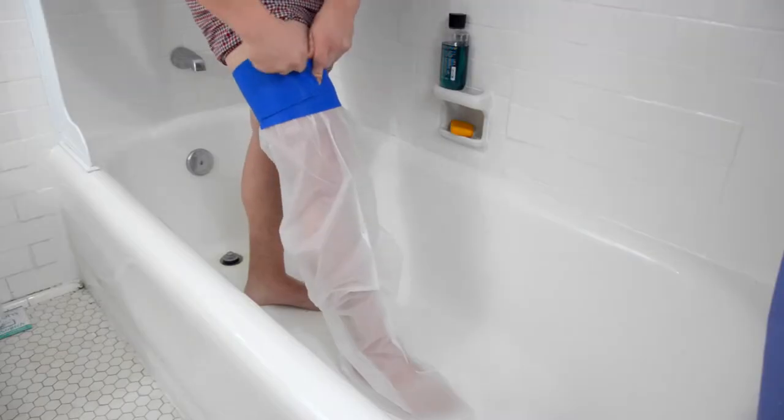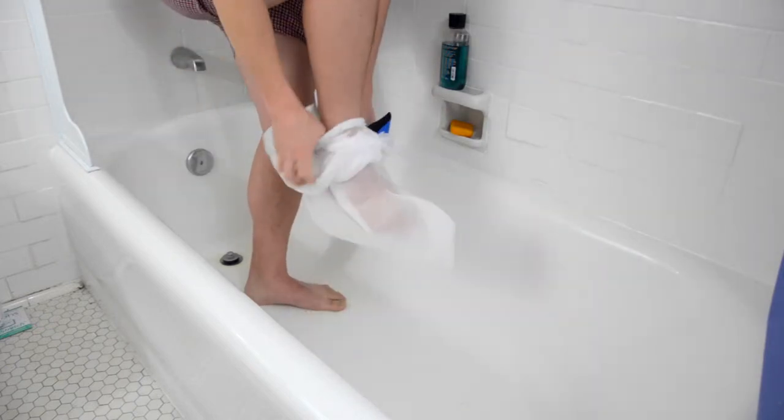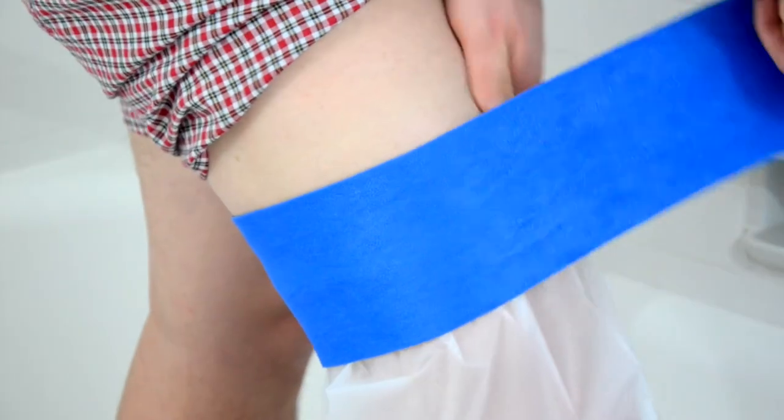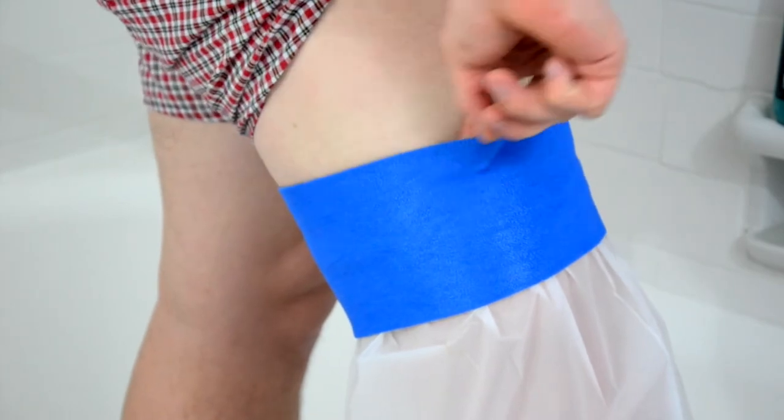To remove, simply detach the velcro from the blue fabric and remove your arm or leg from the bag. For best results, put the hem halfway in between the strap and keep the top layer of strap flush with the skin.